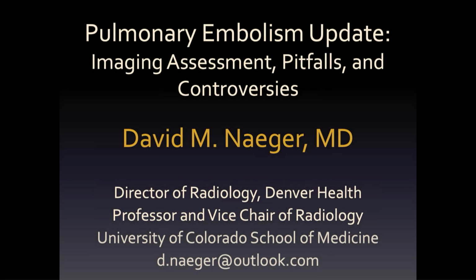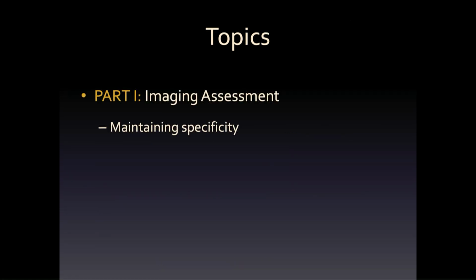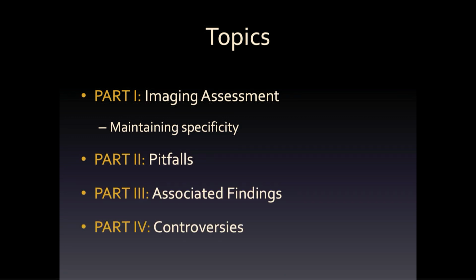Perfect. So thanks for having me, for this chest section. We spoke yesterday about PET and the GU, so excited to be here. So this one's on pulmonary emboli, a core topic. We're going to go through some key things we need to know, imaging, pitfalls, associated findings, etc.